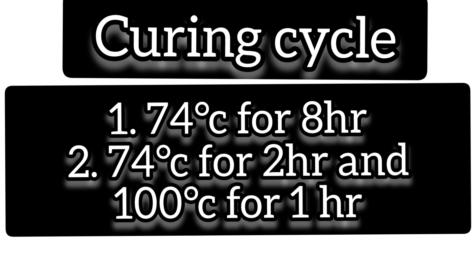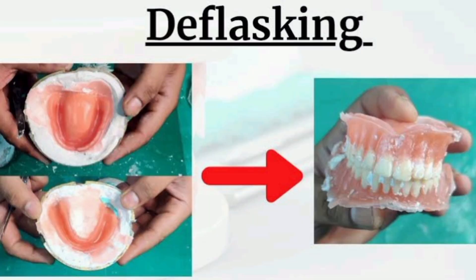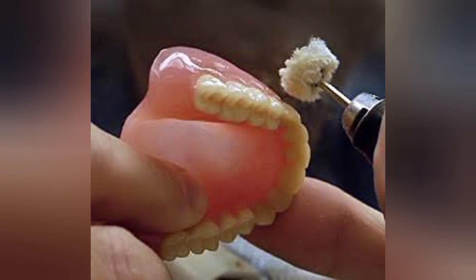After curing, deflasking is done. Deflasking is the act of separating the cast and denture from the flask. One needs to be very careful during deflasking to avoid damage to the denture. It is advised to make cuts through the stone with a saw to separate the dentures and avoid any fracture or warping.